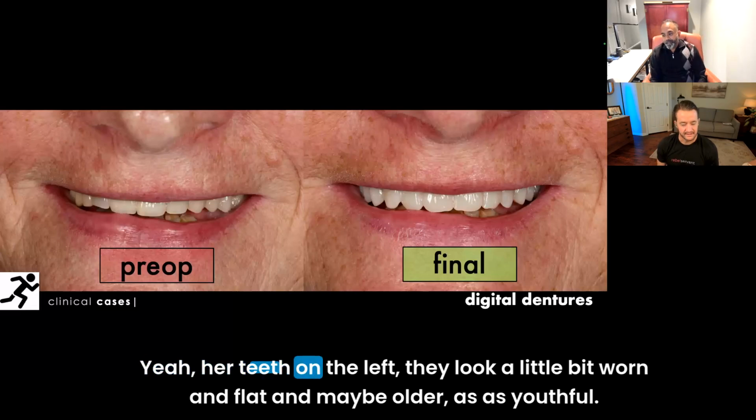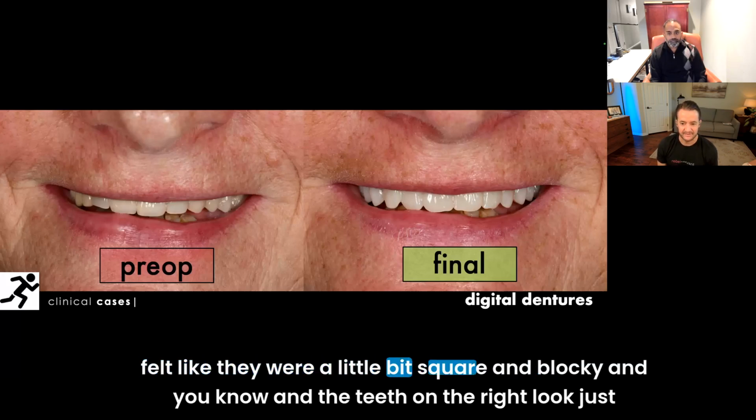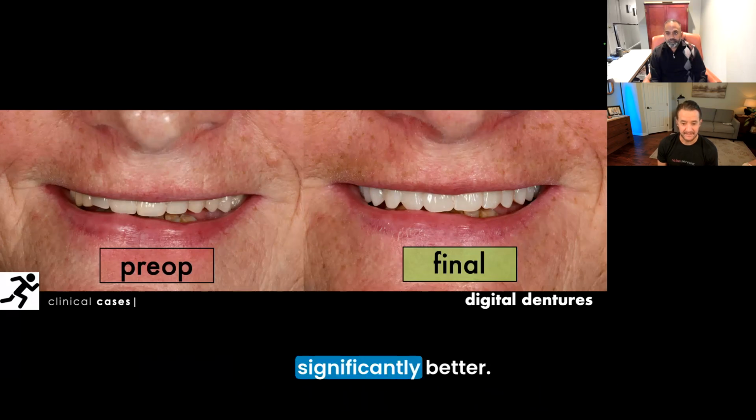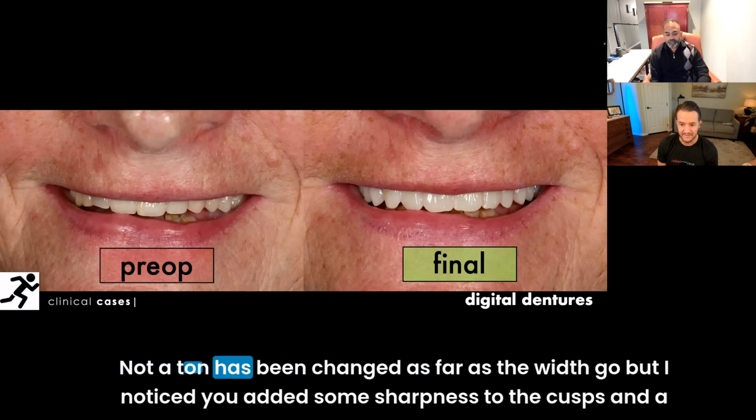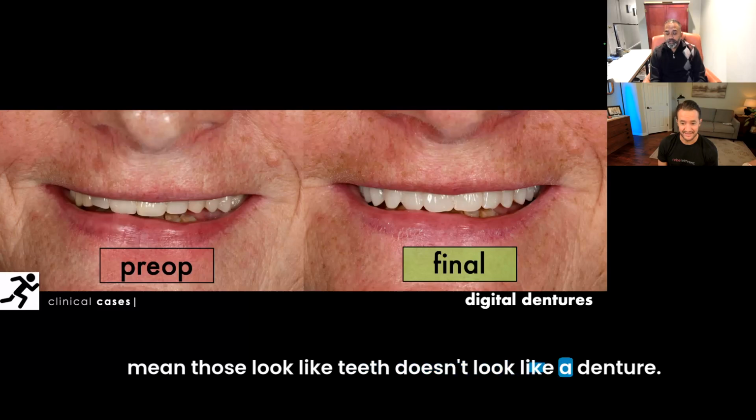Yeah, her teeth on the left, they look a little bit worn and flat, and maybe older, not as youthful, and I could see maybe she felt like they were a little bit square and blocky, and the teeth on the right look just significantly better. Not a ton has been changed as far as the widths go, but I noticed you added some sharpness to the cusps and a little more asymmetry, and it looks super natural. I mean, those look like teeth. It doesn't look like a denture.